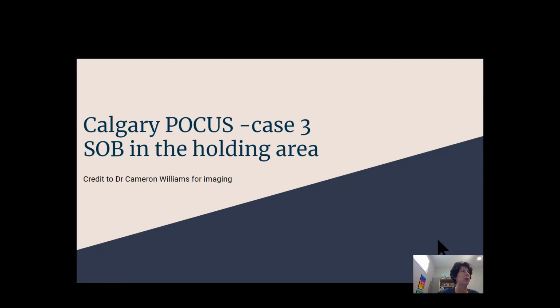So let's get started with our third case of a patient that arrived for an emergency laparotomy, somewhat short of breath in the holding area. The images were done by Dr. Cameron Williams. I have to give him credit for some excellent scanning.